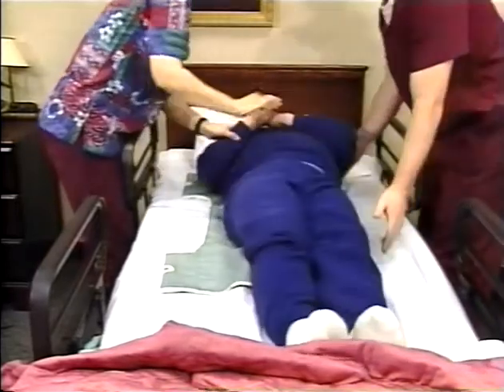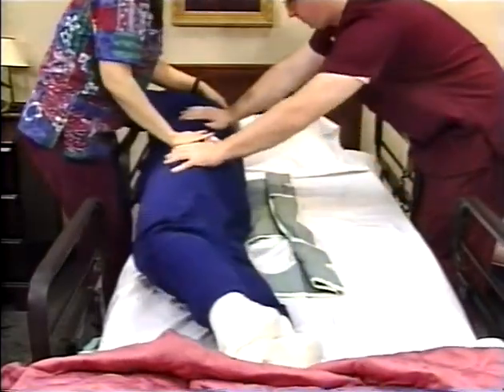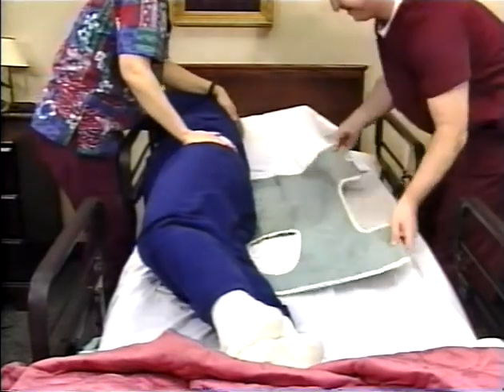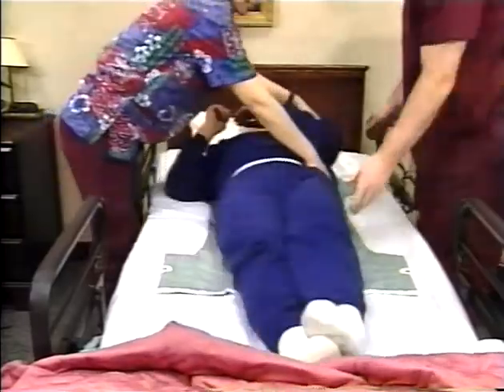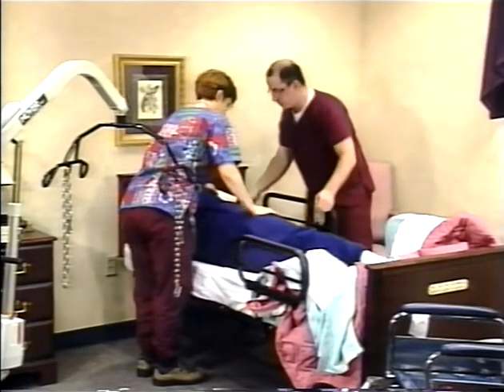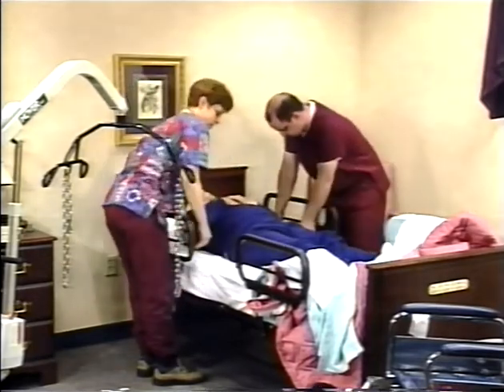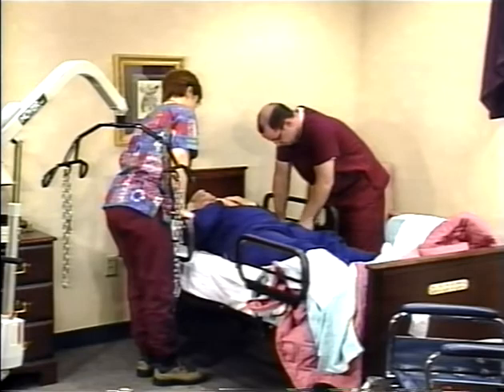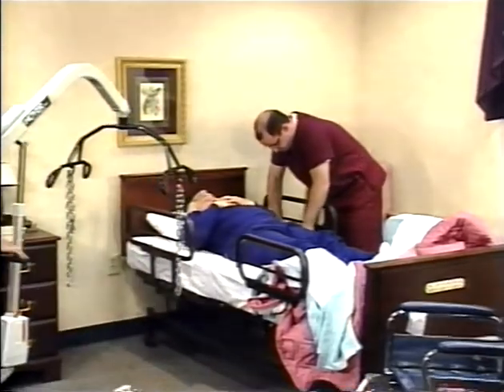Roll the resident onto one side. Place the folded sling halfway underneath so that the lower edge is just slightly below the knees. Now roll the resident back towards you and pull the sling through, similar to positioning a draw sheet. It will help to raise the head of the bed after the sling is positioned to aid in connecting the sling. Now, bring the lifter into position.